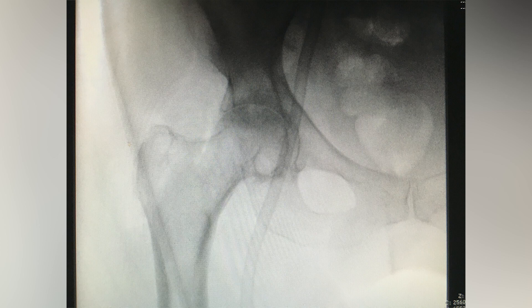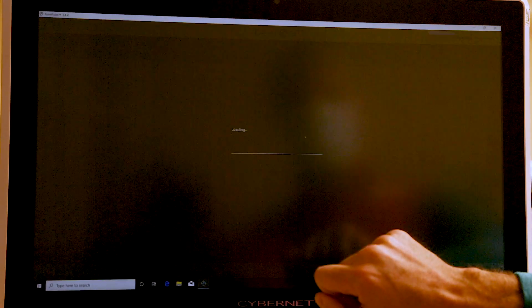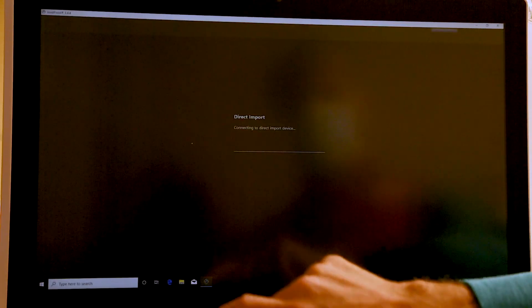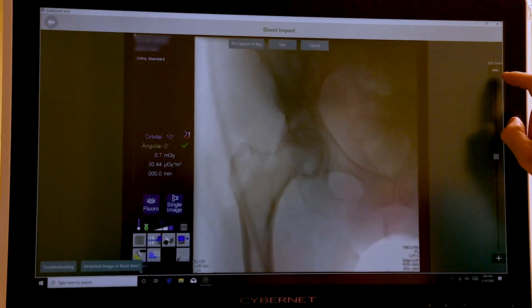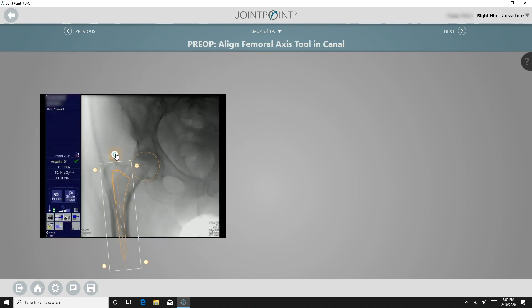This image must include the pubic symphysis and the greater trochanter. This image will later be used for the One Trial Analysis. The representative marks the relevant points on the navigation monitor: first the greater trochanter, then a circle is drawn around the femoral head, the femoral axis tool is aligned in the canal, and the pelvic reference line is marked.